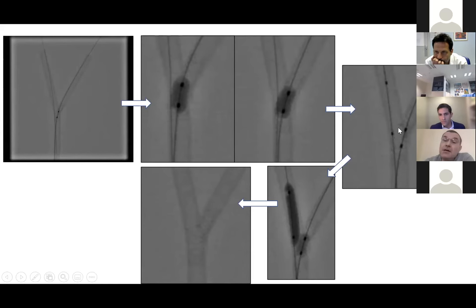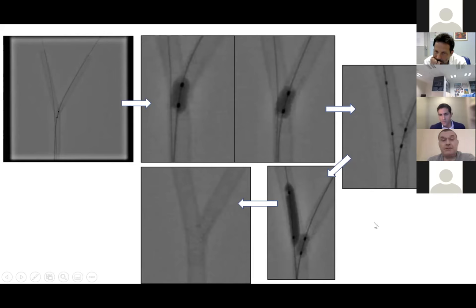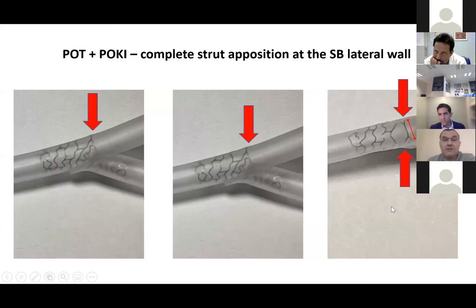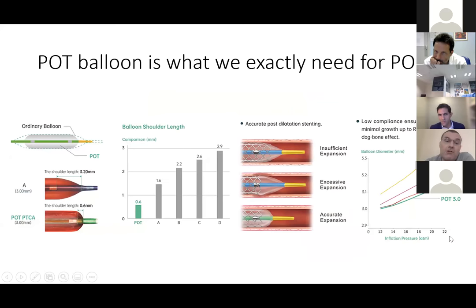The side branch balloon proximal marker was placed exactly at the ostium inside the stent. Then there is an overlap between the two markers, simultaneous inflation. This is the final result, almost the same as in the previous simulation. However, if you observe it microscopically, you will see that there is complete apposition of the stent strut against the side branch lateral wall. This is why the POT balloon is so appropriate for this technique.